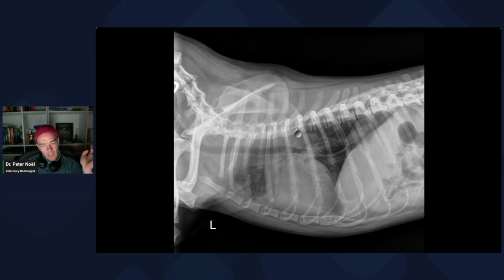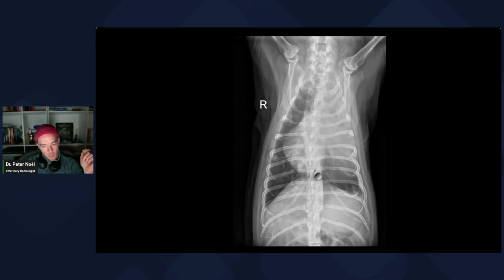So I think this trachea is probably, I mean, first you want to check that the spinous processes look like teardrops, right? The way that I would approach this study is, as some of you have, to look for where there's something wrong, something rotten in the state of Denmark in this left cranial thorax. So there's increased opacity here. But what's interesting is that these spinous processes are pretty straight, teardrop shape, so the dog's pretty straight. And for a barrel-chested brachycephalic that's probably coughing, he's really straight.